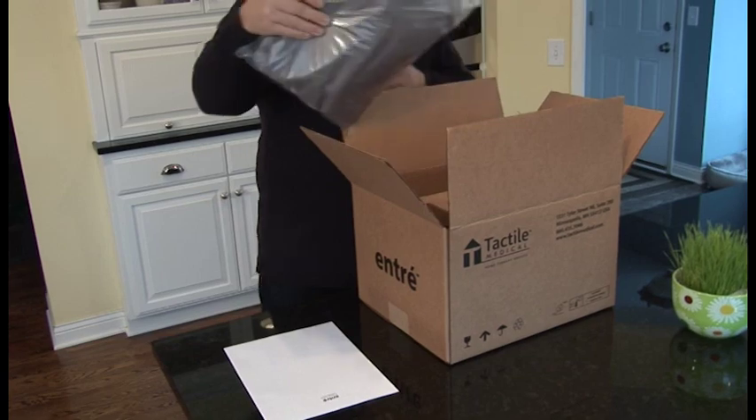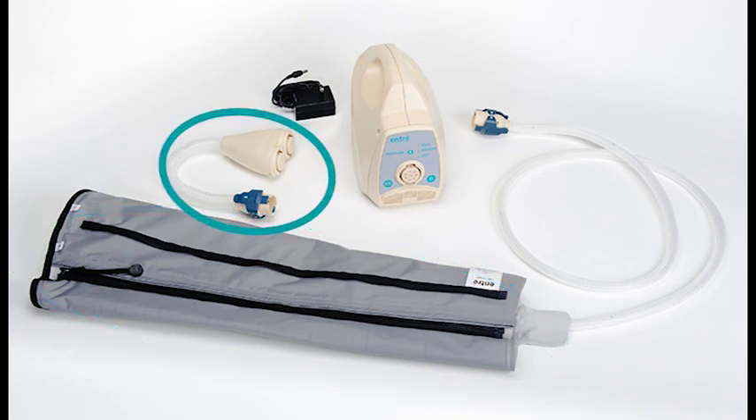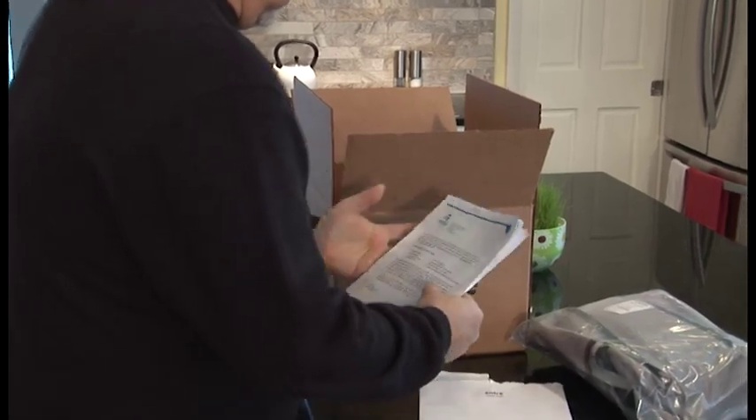The ENTRE system consists of the following components: an ENTRE controller, applicable upper or lower garments, a Y connector if you are prescribed bilateral therapy, a power adapter, user guide, prescribed treatment card, and an ENTRE welcome packet containing important documents.